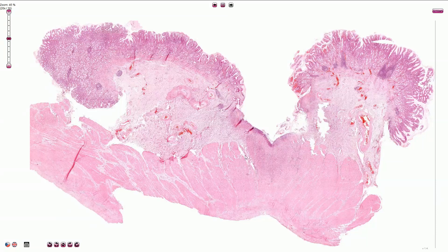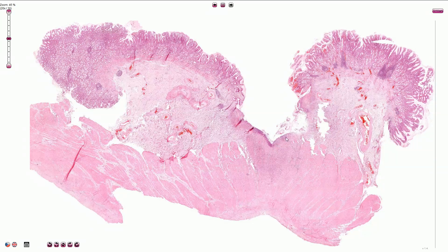This is the wall of the stomach with a gastric ulcer. A gastric ulcer is a localized defect of the gastric wall; in this case it penetrates the whole submucosa and into the superficial portion of the lamina muscularis propria.